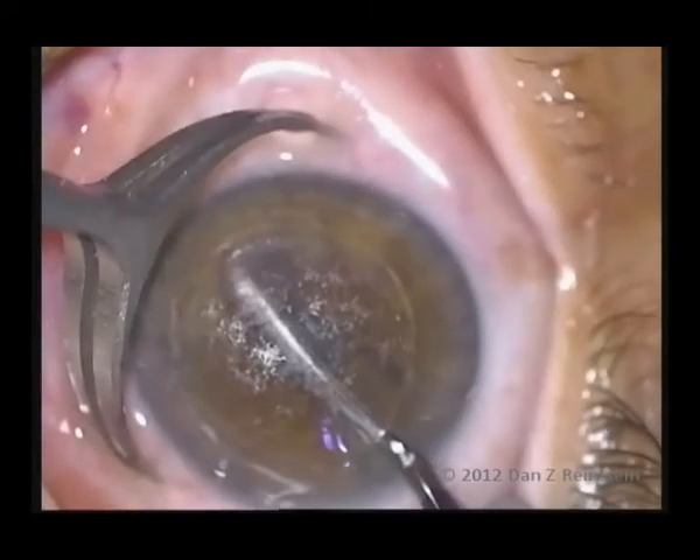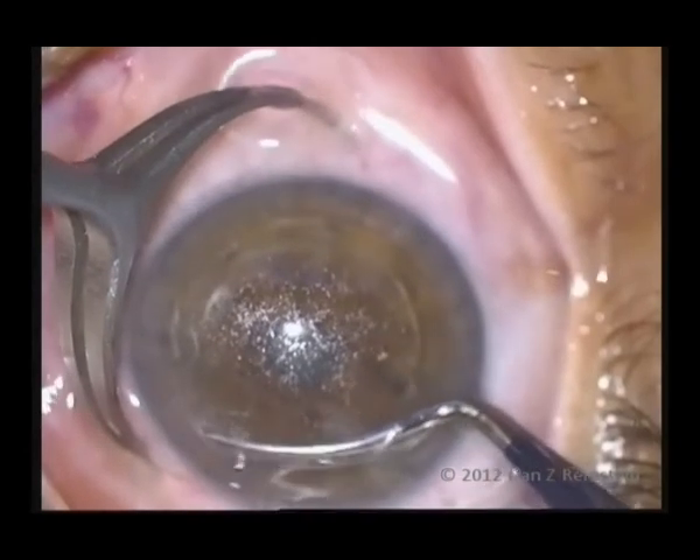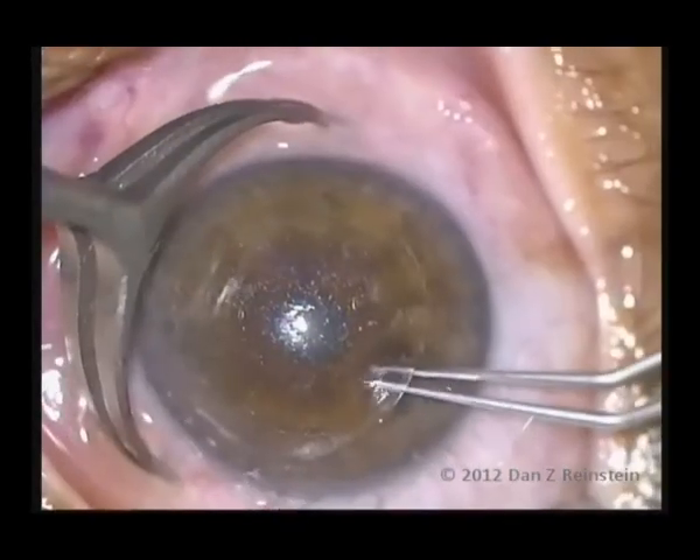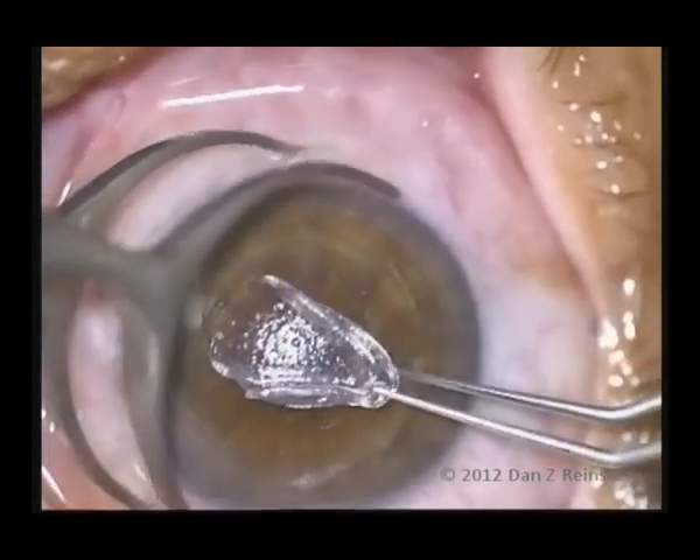The anterior corneal nerve plexus is essentially untouched, resulting in reduced postoperative dry eye symptoms. The retention of uncut anterior stroma, which has much higher tensile strength, allows for higher myopic corrections than usually restricted by traditional residual stromal thickness calculations.